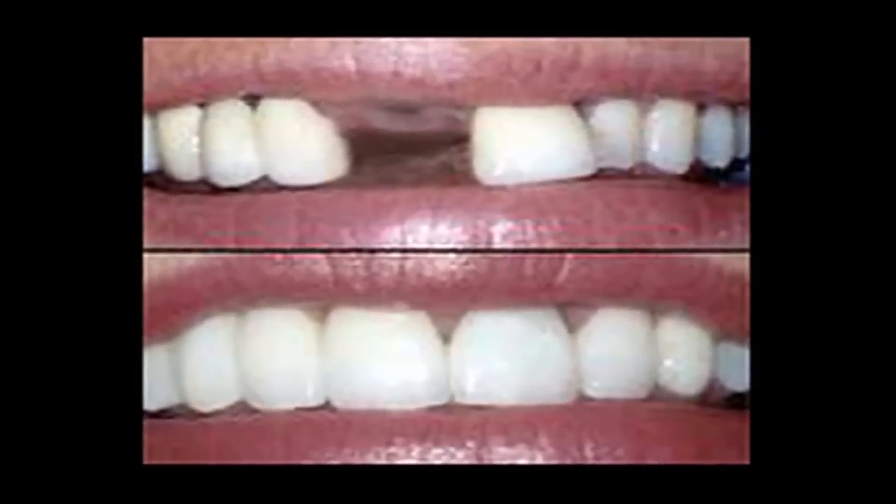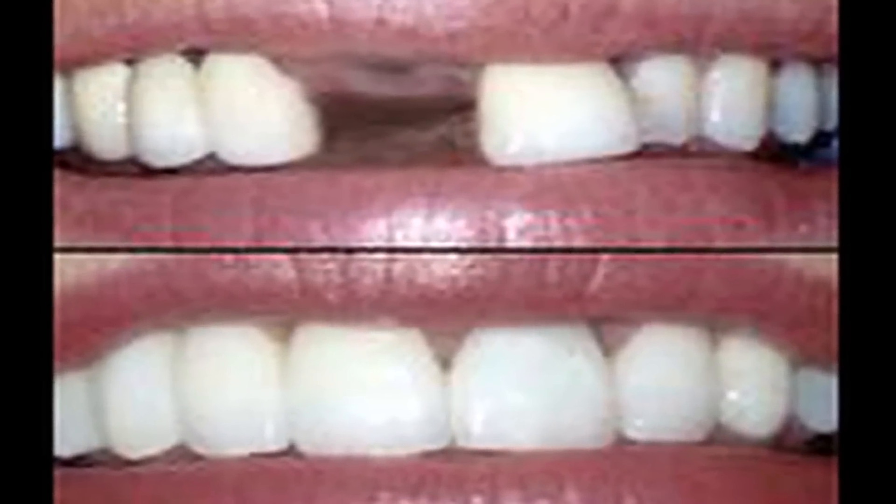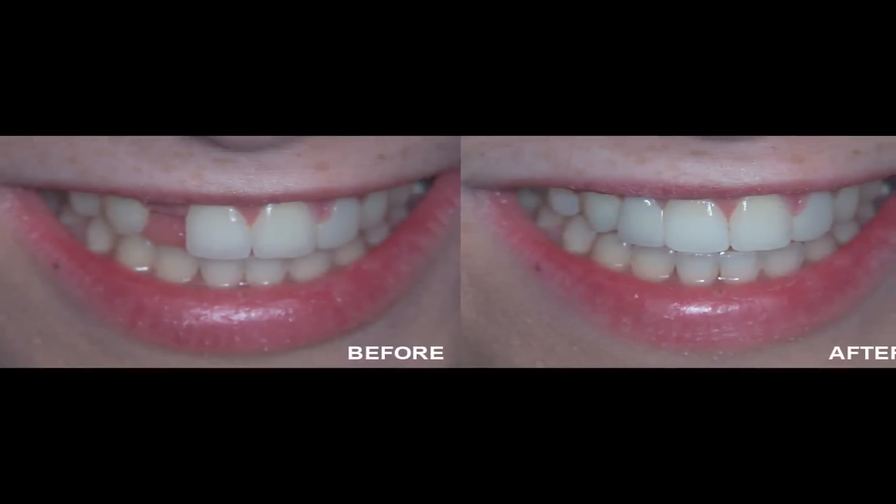There's a patient in particular who came in with a tooth that was broken. He needed something right away because it was his front upper tooth, so we were able to actually use his own tooth and bond it to the adjacent teeth until he was able to get an implant. This is a quick way of doing a bridge without having to send something out to a lab.